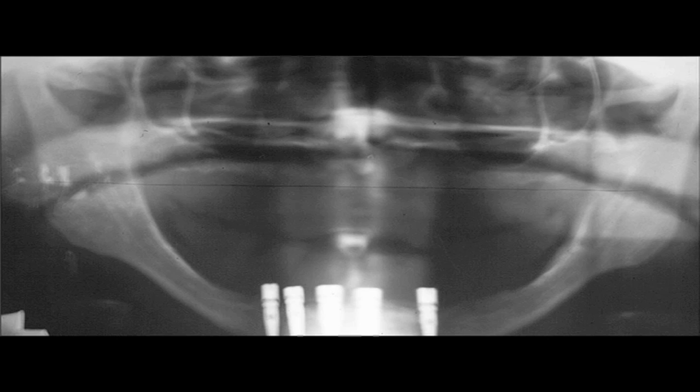So with the prosthesis now anchored, we can now bring the teeth forward past the crest of the ridge on the mandible, which allows for us to bring our patient's maxillary teeth past the crest of the ridge, and that will give us a fuller look, a more aesthetic look, and have our patient smile with confidence.